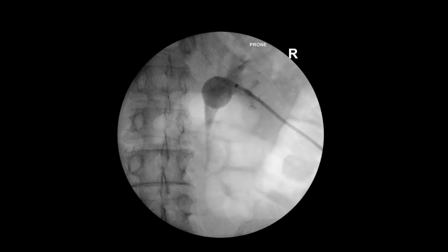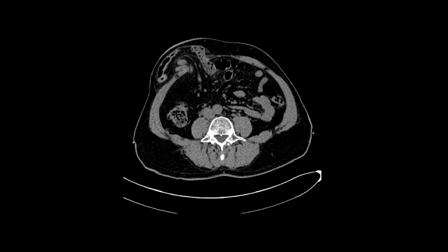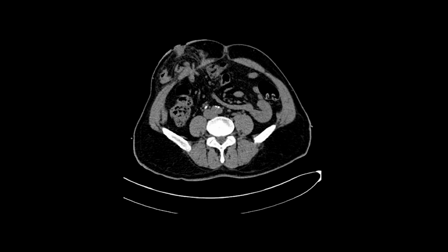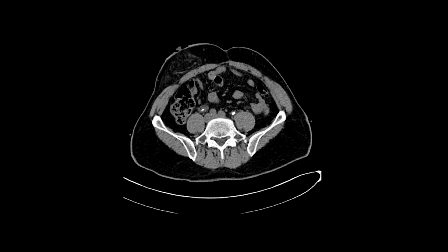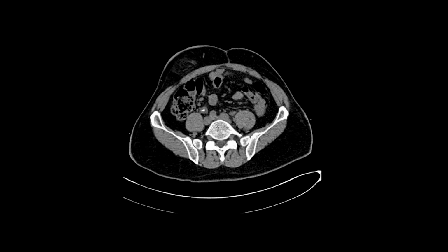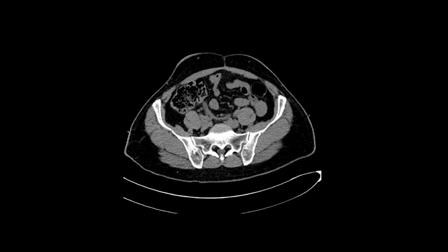At the end of the case, we put nephrostomy tubes in on both the left and the right. And I think a key point in these patients is that you need to do early post-operative imaging. You've got access to the kidney already, that access is precious, and you don't want to lose what you've got if you might need it in the future. Unfortunately, the post-operative CT scan in this patient did show that there was a stone in the left ureter and also some residual stone in the right ureter. Given that this patient has complex anatomy and also had strictures at the anastomosis, the patient is scheduled for reconstructive surgery to reform a new ileal conduit.